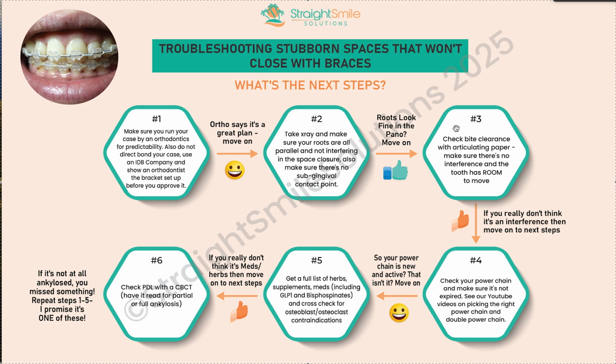Move on. Check your bite clearance, because if you do not have overjet, you can't close spaces. They might be there, but they're not gonna close if you don't have the overjet, because there's an interference, right? So you have to create overjet sometimes in order to close spaces. So that is what this means. It should not be anterior contacts. This, too tight, can't close spaces. All right, no interference, move on.